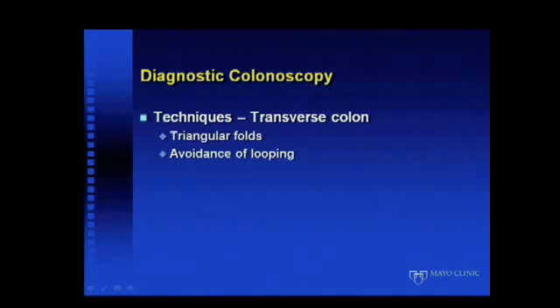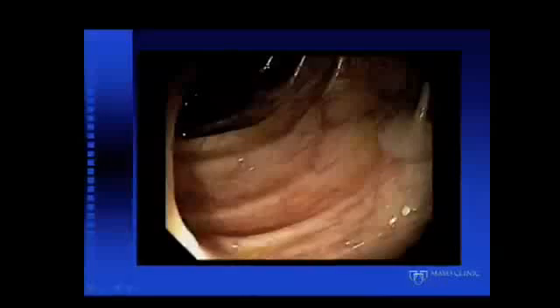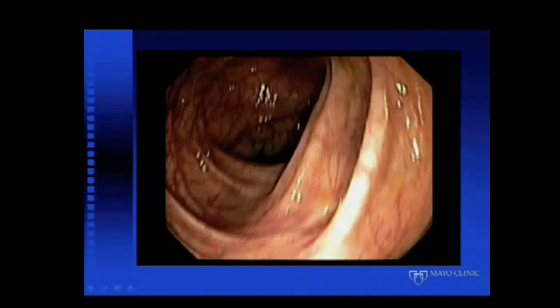In the transverse colon, this is recognized by the classic triangular folds. There are triangular folds in the descending colon too, but typically the corners do not approximate there — whereas in the transverse colon, they do. In a patient with redundant transverse colon, which can dip well into the lower abdomen, it's important to avoid looping, and abdominal pressure can help. With some of the lesser-volume preps we're moving to, there seems to be more retained fluid — it feels a little bit like spelunking sometimes.